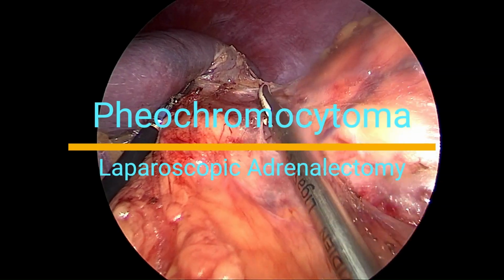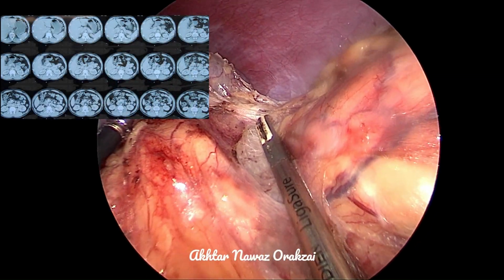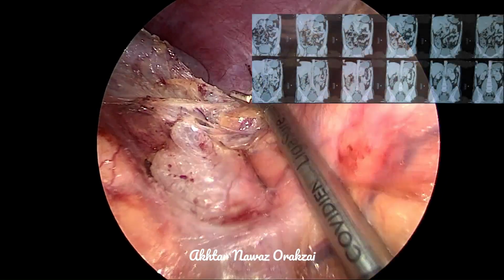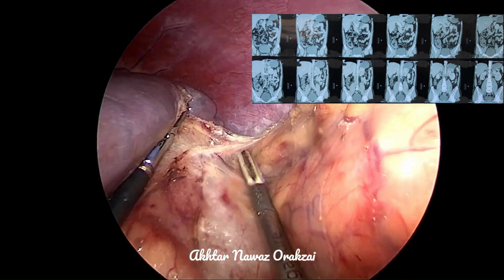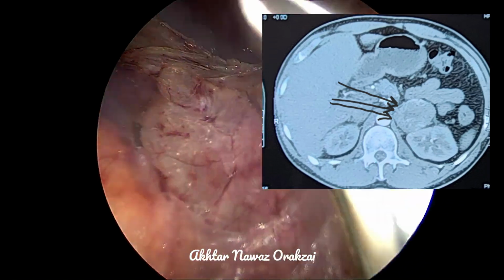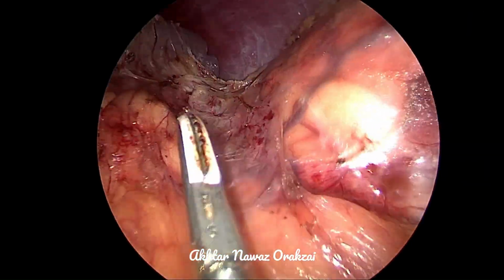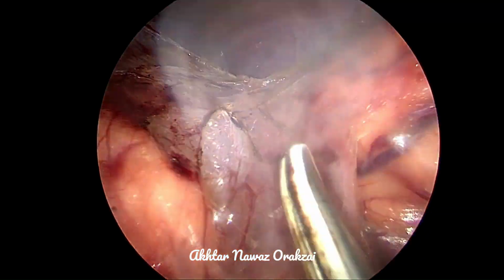Today we have a case of Pheochromocytoma, around 5.4 centimeters in the left adrenal gland, in a 24-year-old male patient who is a laborer by profession. We are mobilizing and medializing the colon. Here you can see this is the pancreatic tail, and that is the spleen.